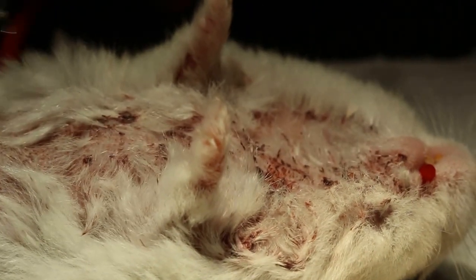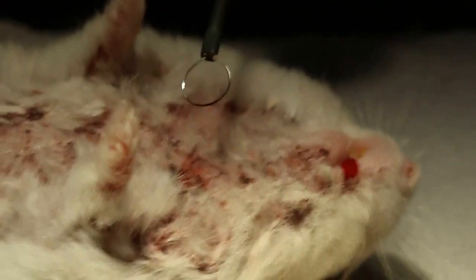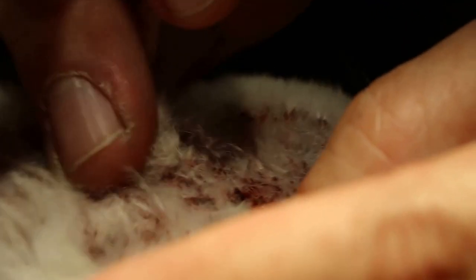And now we have to clean up the whole place, use facial cotton. See any more? Check — no more. So this all matted hair, matted — clean up now.